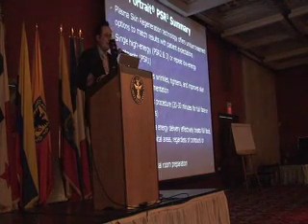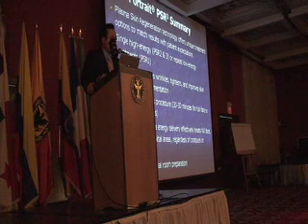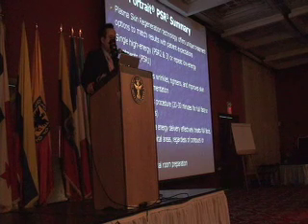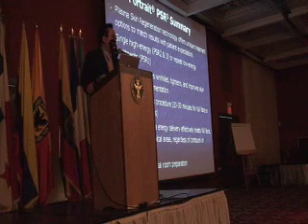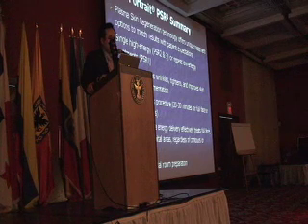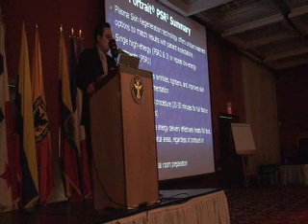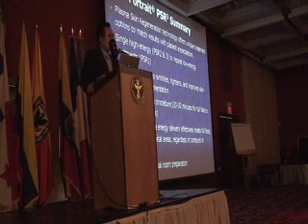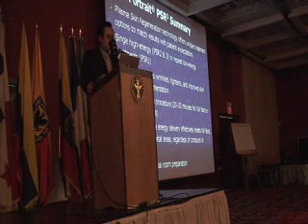So in summary, this is a brand new technology. It is not a laser, it is not a light device. And you can choose between high and low settings, although if you're dealing with Fitzpatrick 4 and beyond, which probably is mainly here in Bogota, you are probably dealing primarily with the lower PSR1 settings. And there is a nice change for the aging face, with, I would say, the safety and recovery of a peel with a result that approximates but does not equal CO2.